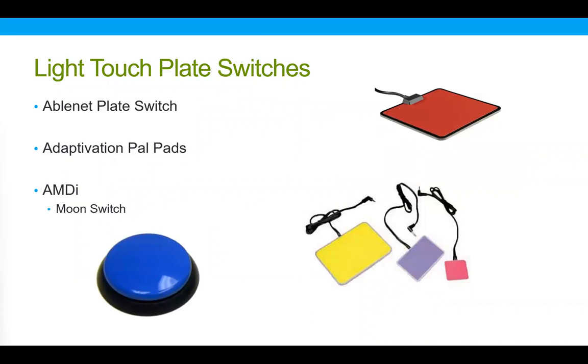Then we move into light touch plate switches. Now, these are sometimes not more sensitive necessarily than some of the other plate switches, but they are designed specifically to be very light touch. Some of these are also less durable, so it's important to keep that in mind.